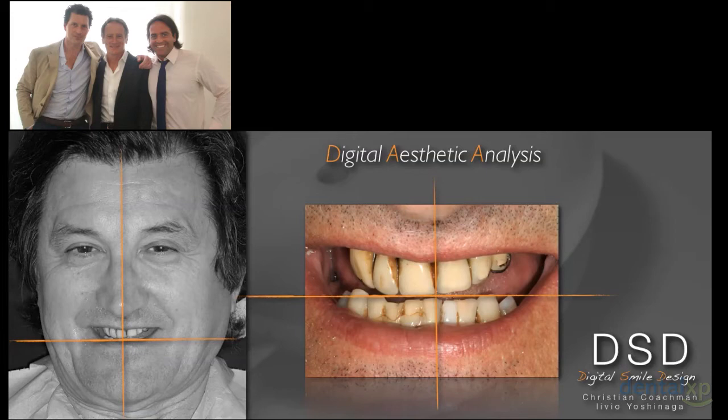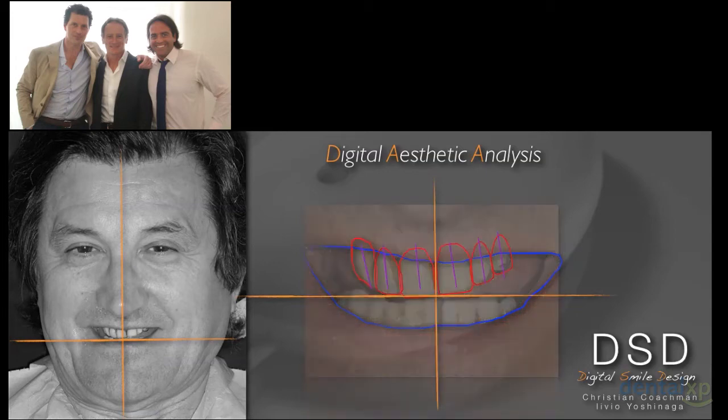We can evaluate our patient, the lips, the teeth, the axis of these teeth, and we can see with and without the picture what we can improve, and we can make a hypothesis digitally of a treatment plan.